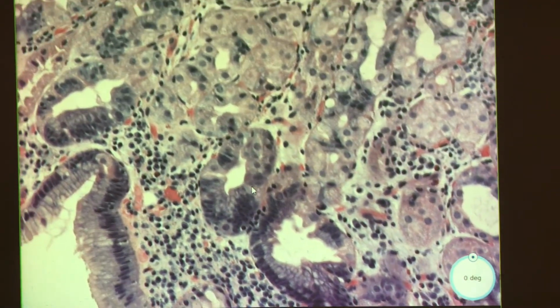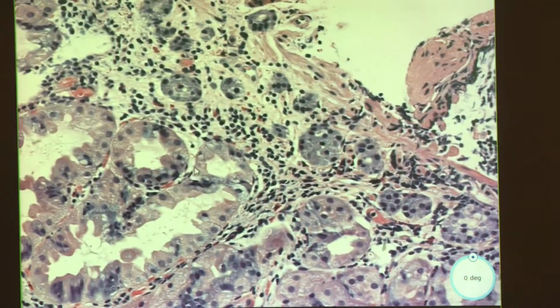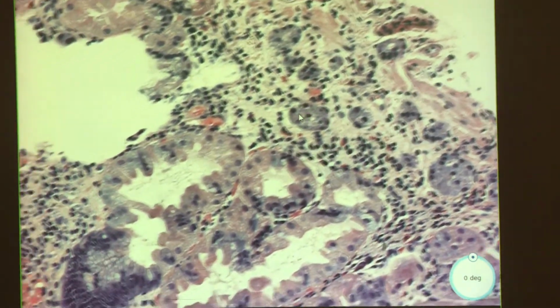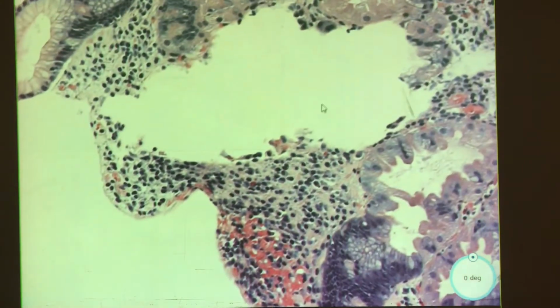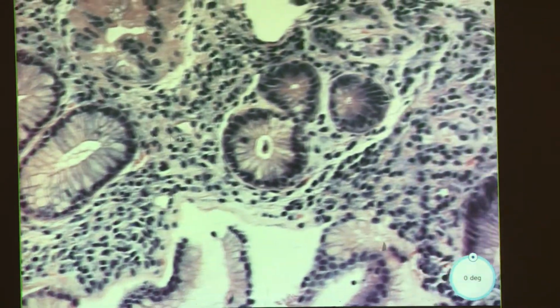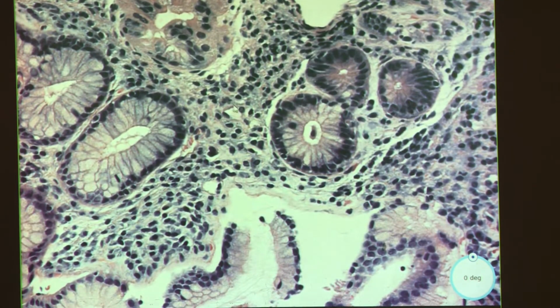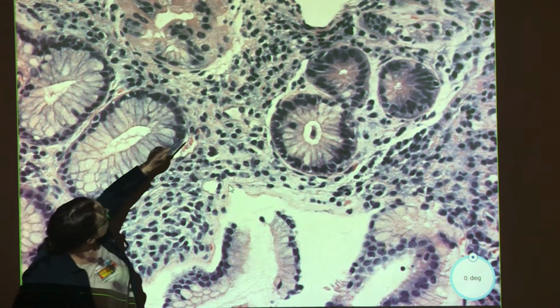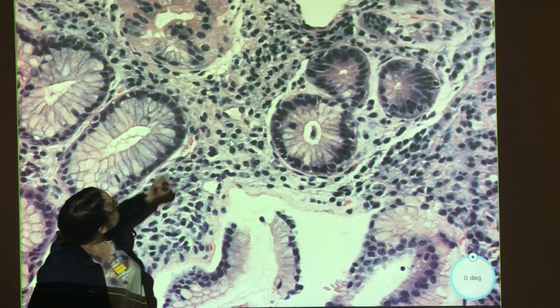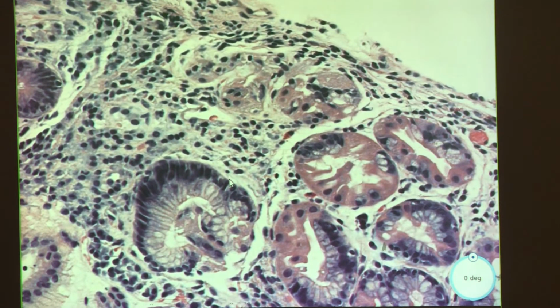So help me with mast cells. I've seen it here and there. Let's see if we see them in here. This one I think was more lymphoplasmacytic, because there's not even a lot of Eos in this one. But yeah, maybe there's some there, hard to tell, maybe some of these guys. Okay. It's kind of hard to tell, but they should have more cytoplasm, and they tend to be fluffier.